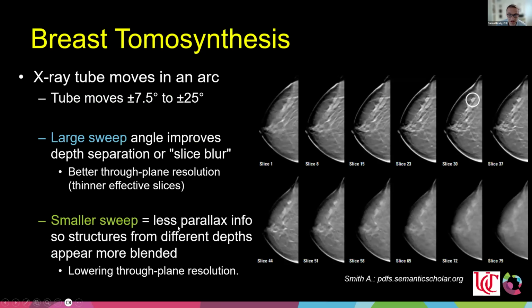So you've all seen tomosynthesis images. We basically image the breast into 3 dimensions and cut it up like a loaf of bread, or slice it up, and then you can sort through it with your mouse, and you can go up and down or through the z-axis of the breast. And any disease that is in focus on one particular depth of the breast will become very easy to see, whereas it's more obscured at the higher and lower levels because of the overlapping anatomy.